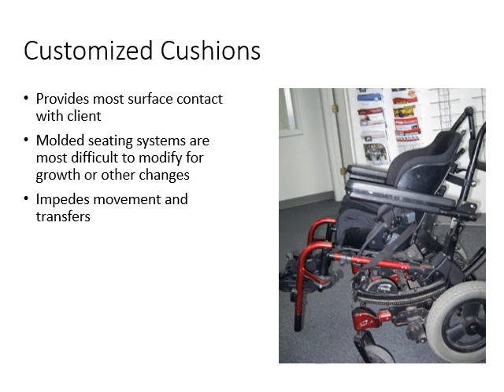Customized cushions, on the other hand, are designed to be matched specifically to the client. They provide the most surface contact with the client, so they're also going to be more contoured toward the client. They might be a little bit more difficult to transfer out of, but that's okay because if the client is going to be sitting in the chair for extended periods of time, we want the contour to conform to their body without any areas of pressure. So these are molded seating systems that really closely almost hug the patient.